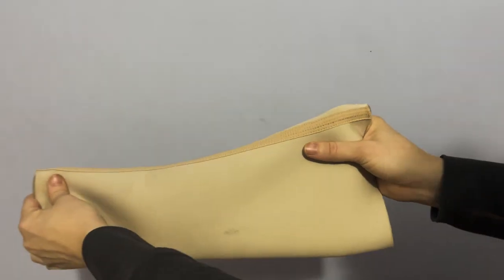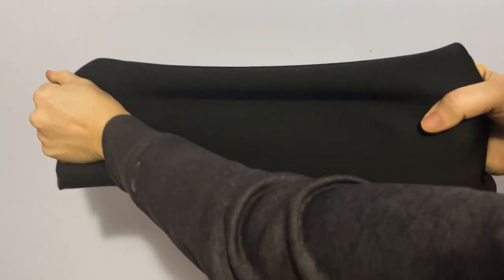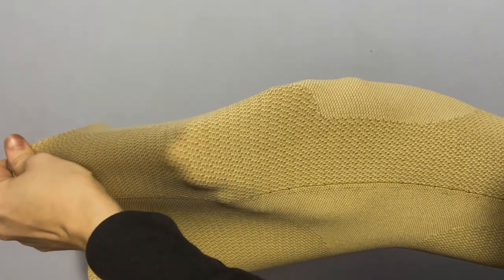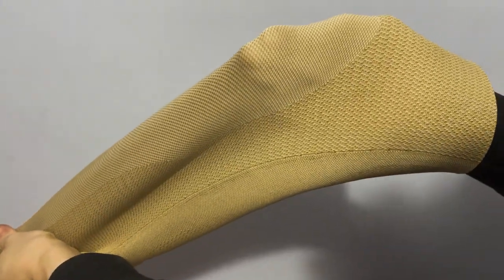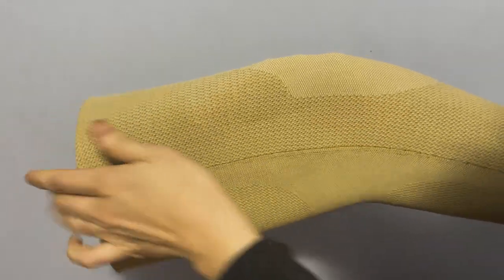The sleeve is going to be similar material to the liner, and I think about them in three broad categories. Ones that are a little bit lighter weight that have more stretch. Ones that are a little bit thicker and more heavy duty that have less stretch. And you're also going to have ones that are pre-flexed at the knee. And some, like this one from Alps, have a fabric matrix that intentionally allows for less stretch in certain areas and more stretch in other areas, such as around the knee.